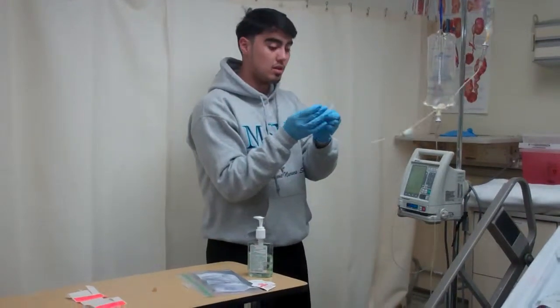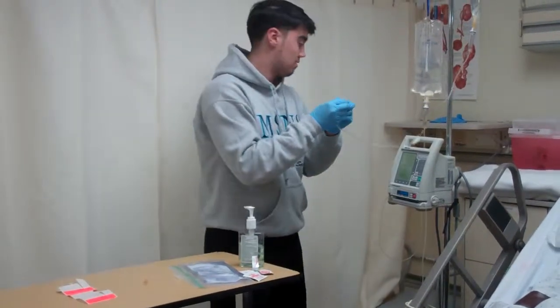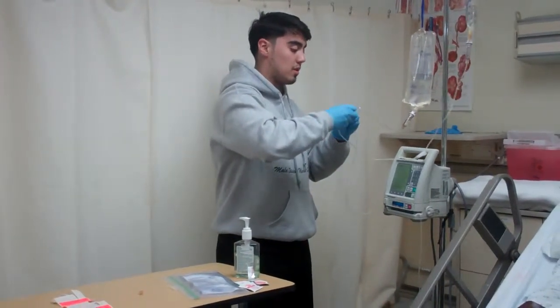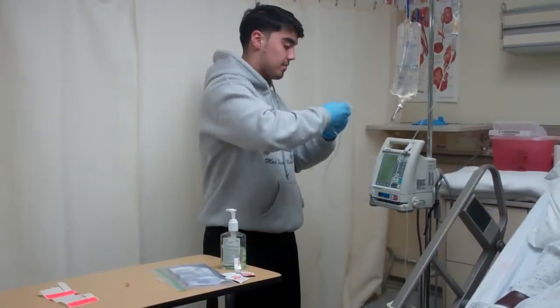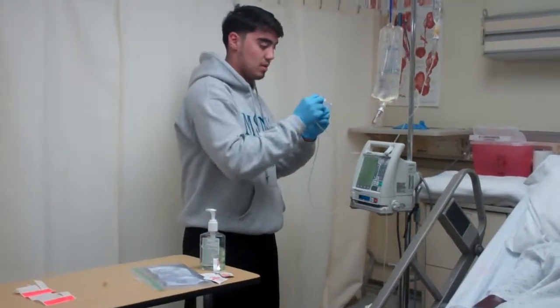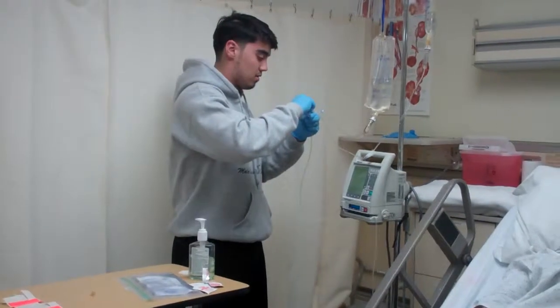And what we're going to do is go ahead and get an alcohol swab, alcohol prep pad, and then we're going to get it to the topmost port that's closest to the primary. We're going to swab for 15 seconds. Go ahead, put that in the trash, connect it.